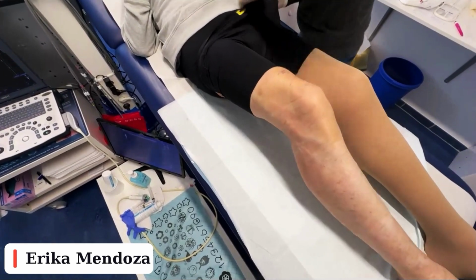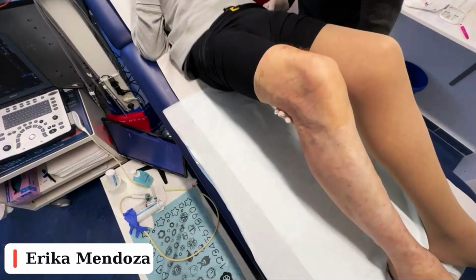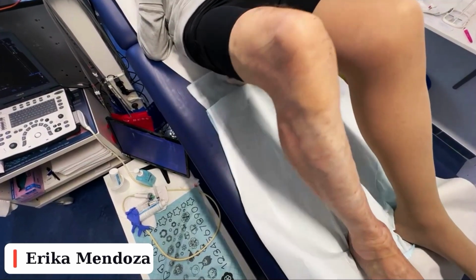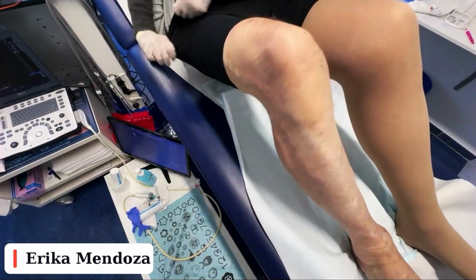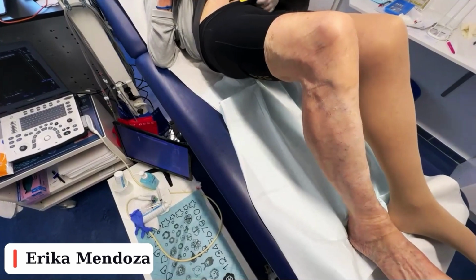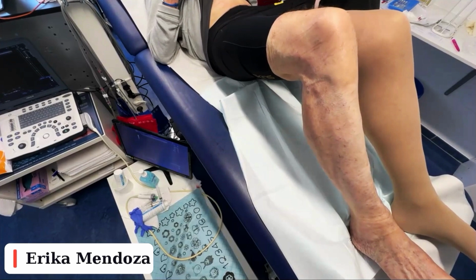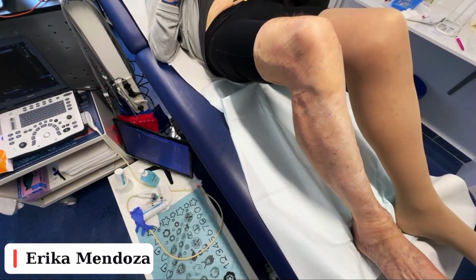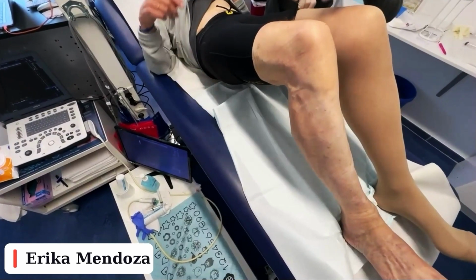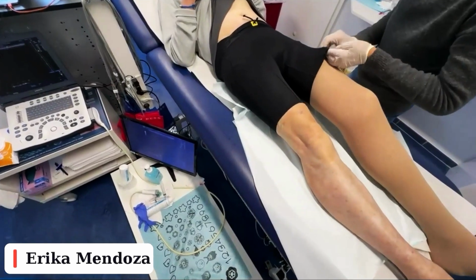No, it's true. I see a very interesting question there from Baha Rifai. How many days would you wait? This is a real good question. For the dosage I am allowed to apply, it's 24 hours, because you can apply 10 mils of air in 24 hours. But I normally let the tissue react and wait 1 week for the next session. This is in normal varicose veins.